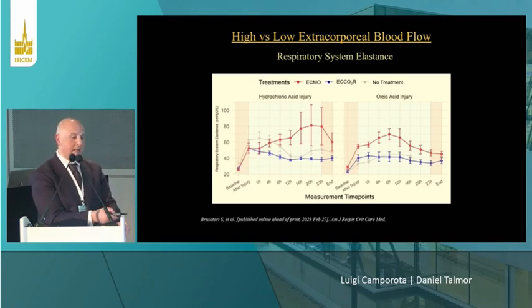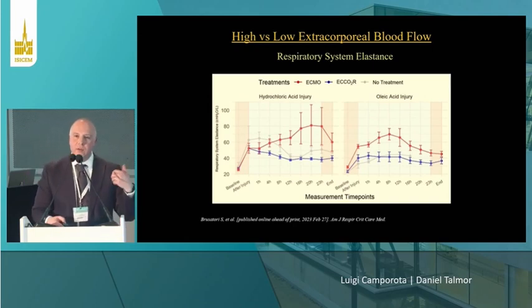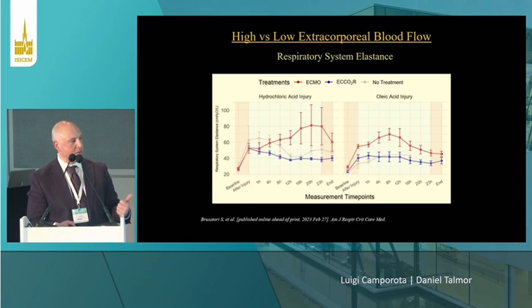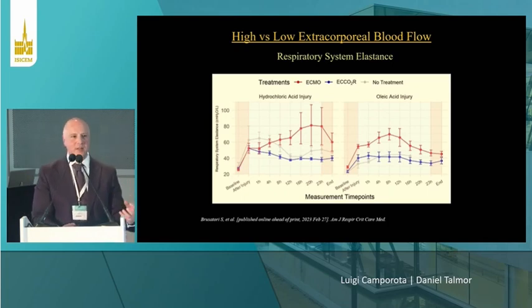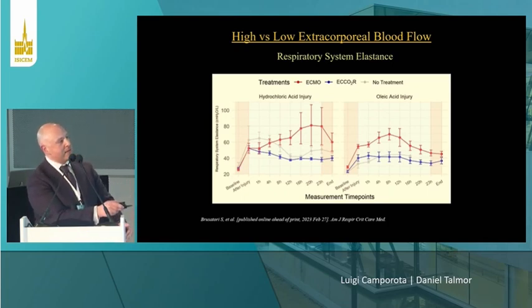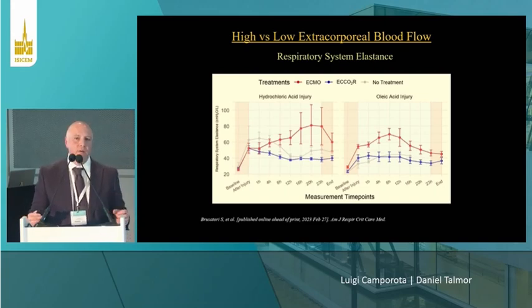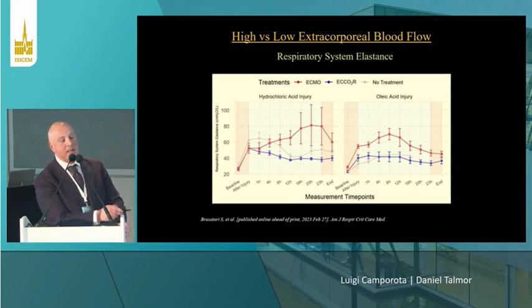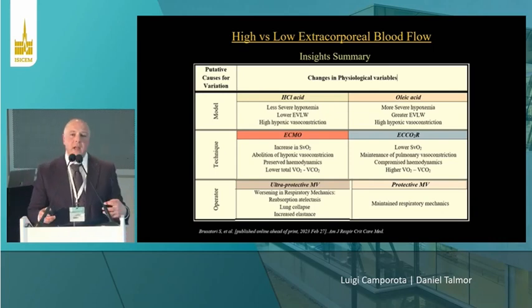And now what I want to show you here is the effect on the lung per se. So now you can see this paradoxical effect. Again, look at the ECMO over time. We've seen that although the carbon dioxide was well maintained and the oxygenation was well maintained, the lung continued to deteriorate. So there is a price to pay for ultra-protective ventilation, because over time, the elastance of these lungs continues to increase in the ECMO-treated group, whereas in the extracorporeal CO2 removal group, because we were not aiming at ultra-protective, we couldn't afford ultra-protective ventilation, the lung maintained a certain elastance. So that's quite important.